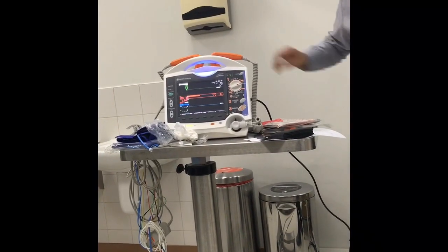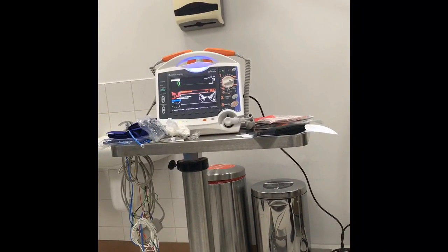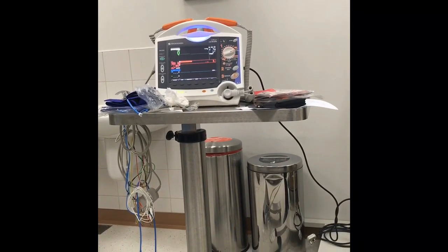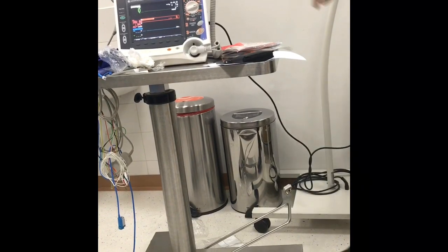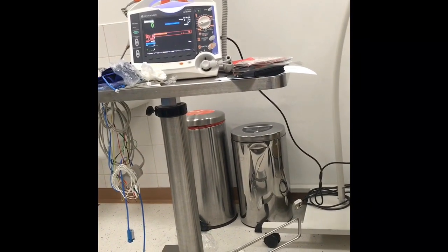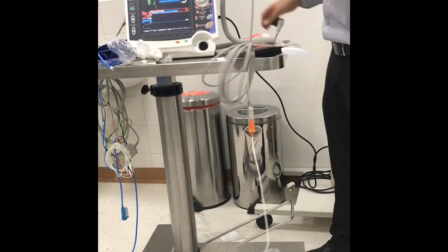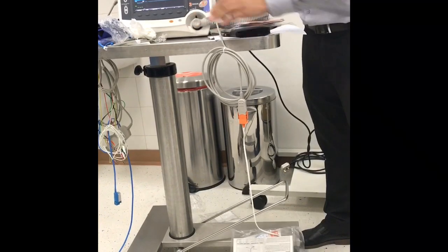You have a question? For AED mode, I have to use my circuit now. Take this one out. And usually I think they keep this one connected to the machine. I have the AED pads. AED mode, adult mode. Confirm the patient is not responding and is not breathing. Same scenario as the AED machine. Remove all clothing from the patient's chest.